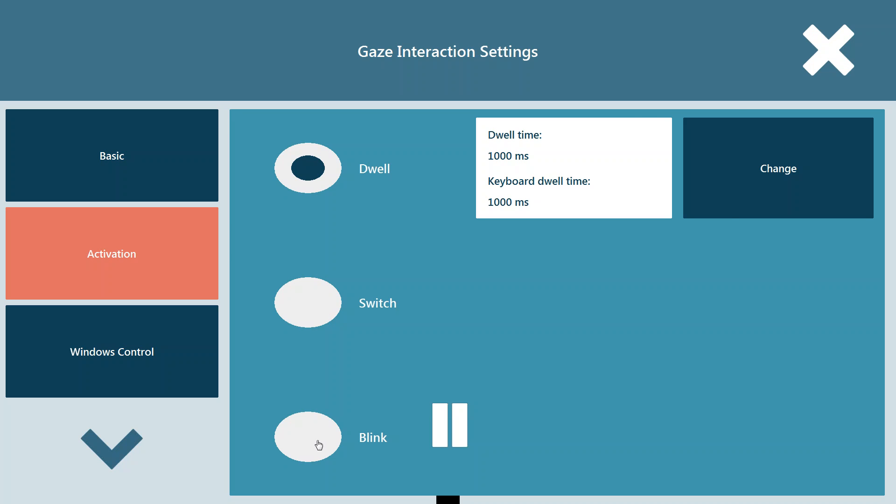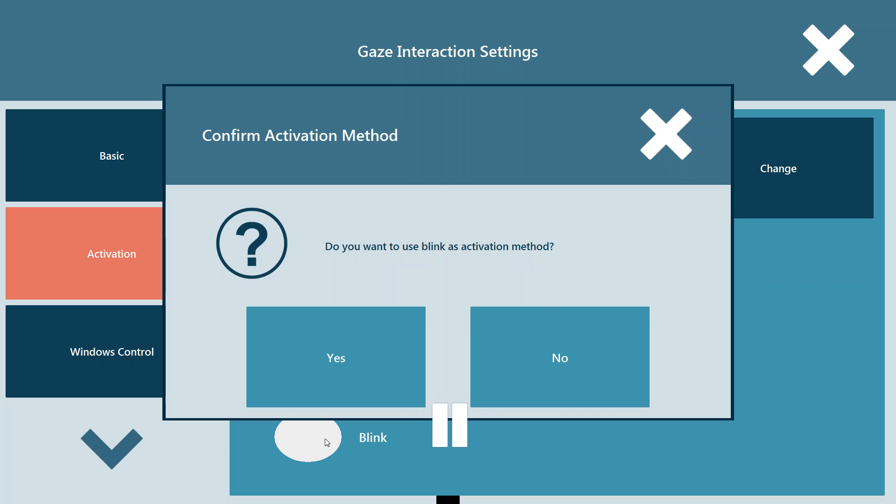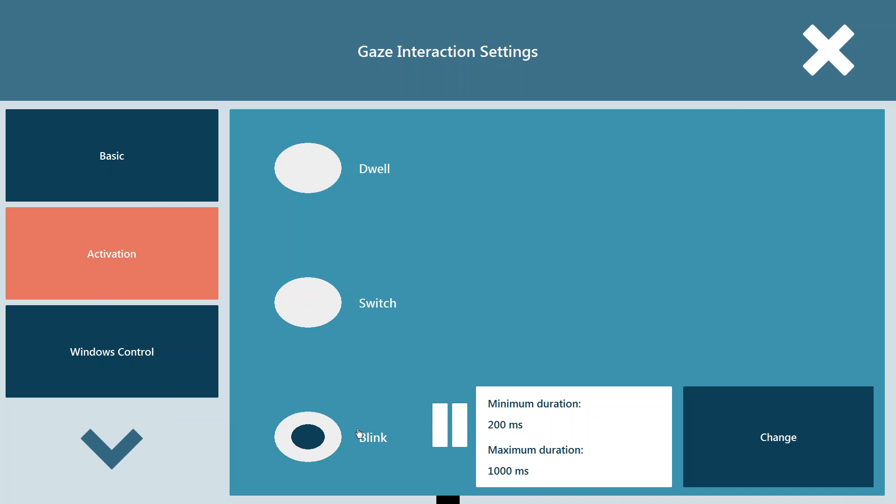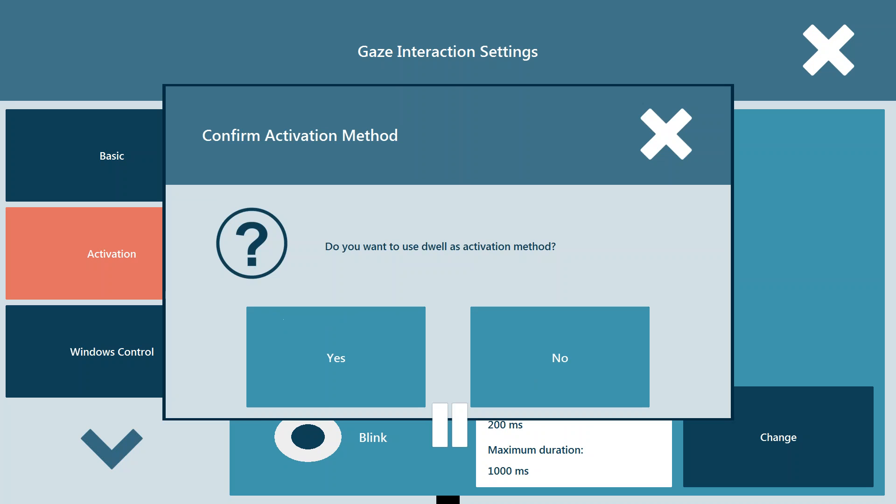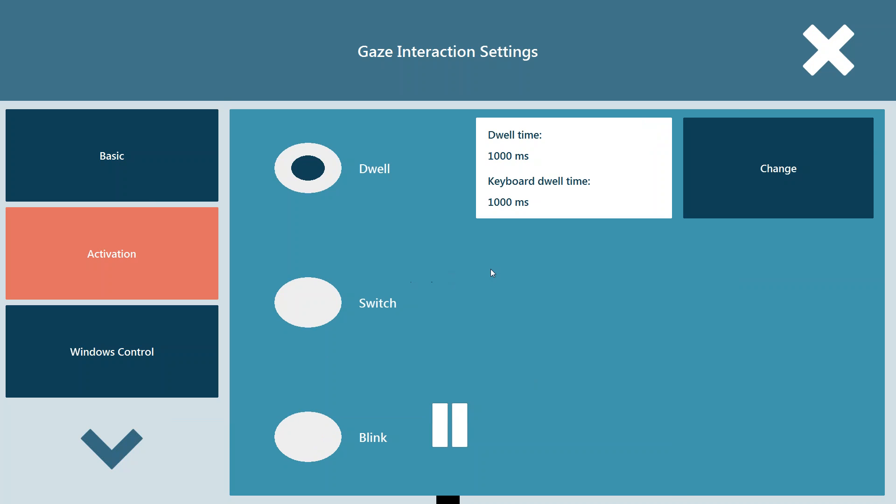And lastly, we have blink. Blink allows you to set a duration time so that when you're looking at the button, you have to make a purposeful blink. In this situation, I have it set between 200 milliseconds and 1000 milliseconds. So I have to keep my eyes closed for a period of time between 200 and 1000 milliseconds for it to act like I'm clicking that button. Blink and dwell are probably the two most common access methods at this point. I'm going to use dwell because that is what defaults, so it's what most of you are going to see when you first start up the unit. But please feel free to come in and explore and find out what works best for you guys.